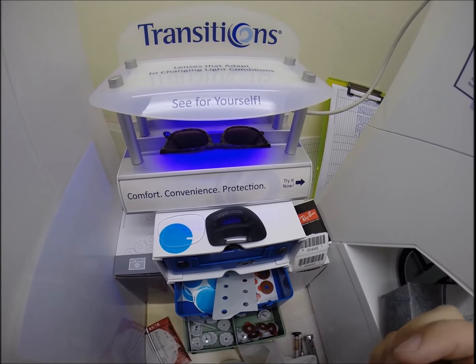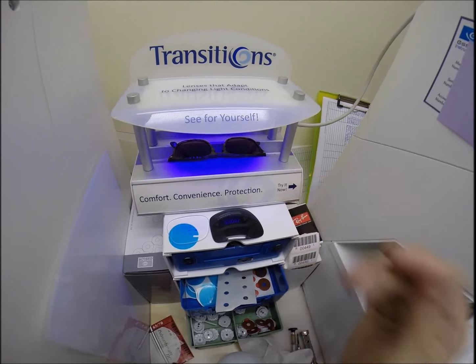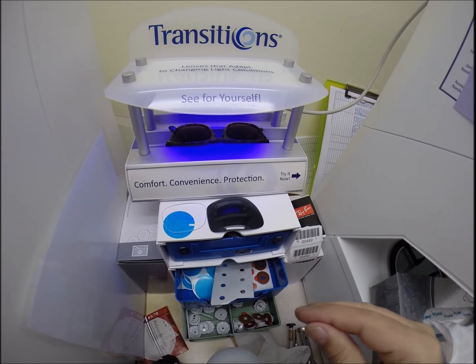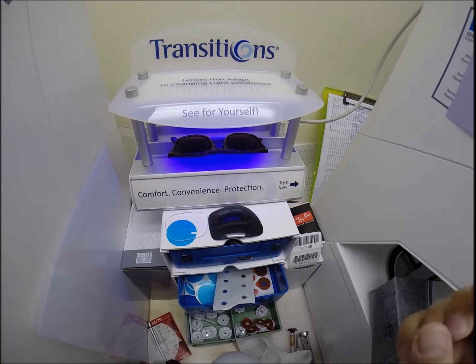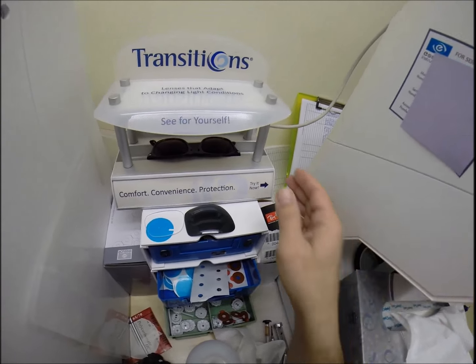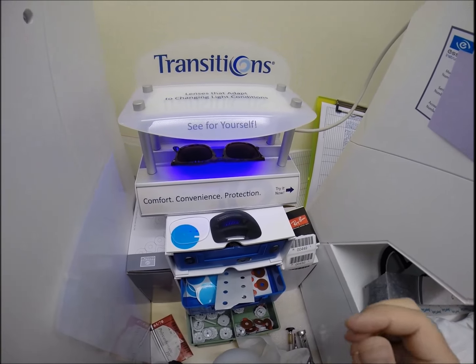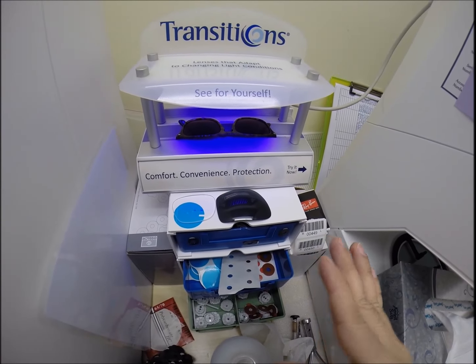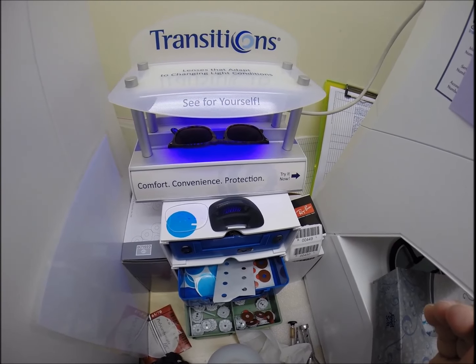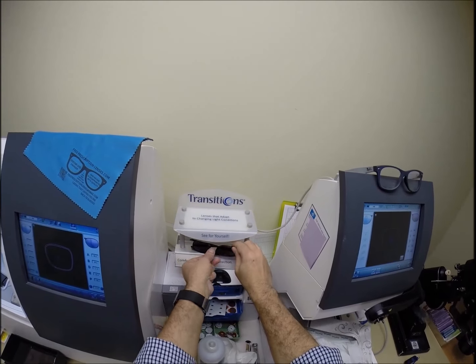The pupillary distance is 68. I place the PD stick against my thumb on your right lens, then hold it up to the left lens - getting 68 millimeters, so that is cut perfectly. Black dot to black dot on both lenses - they overlap. I want to check the OC height of 24: placing the PD stick against my thumb on the right lens, going to the bottom of the lens right before the frame - getting 24 millimeters, so that is perfect. Same thing on the left: right before the bottom of the frame, 24 millimeters. So that is cut perfectly.